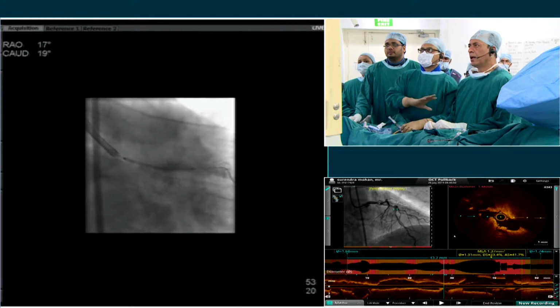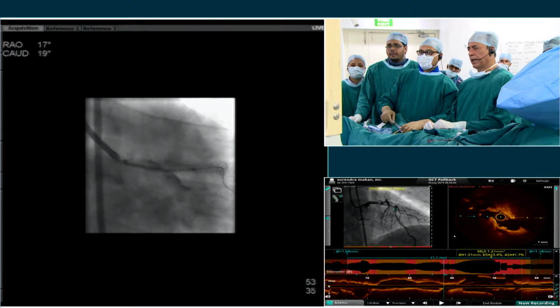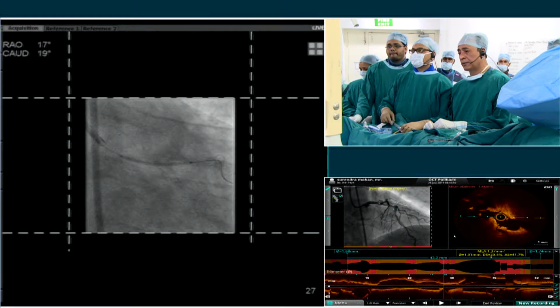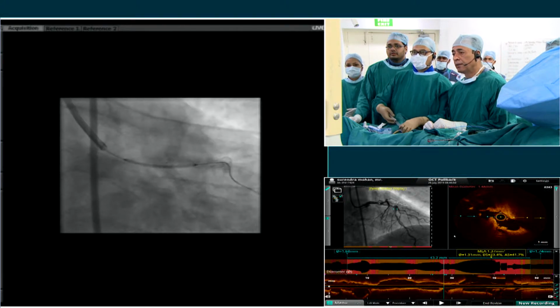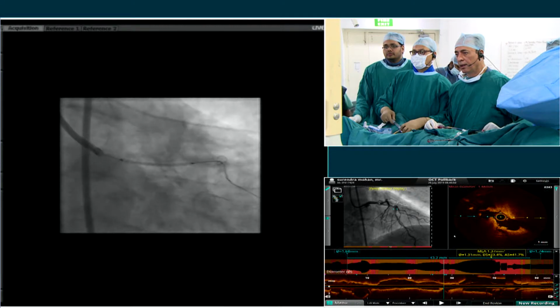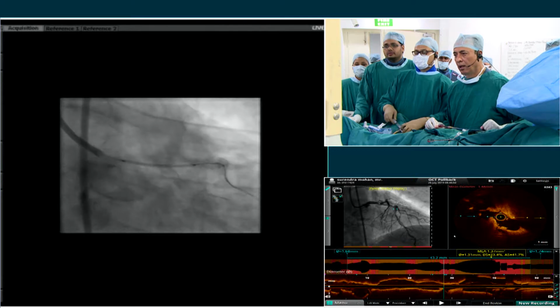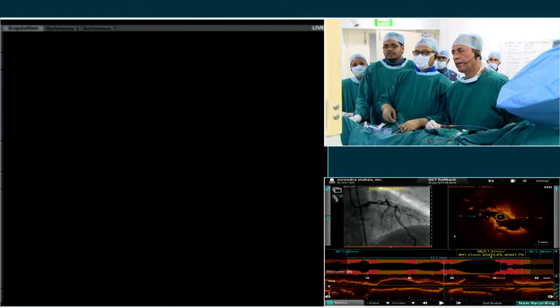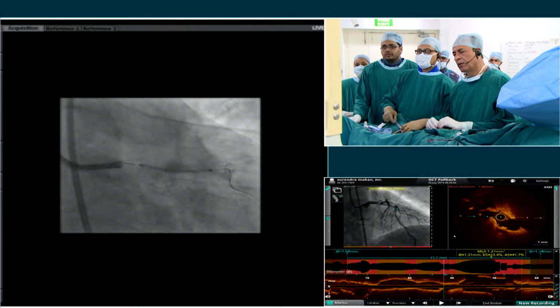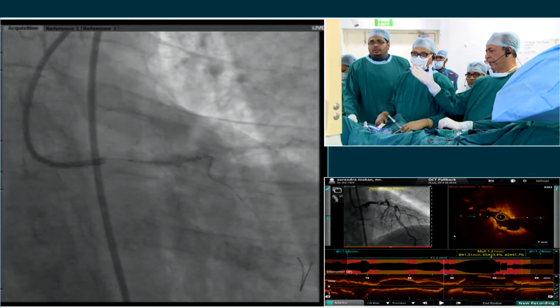No. Which stent are you using? Yeah, we are missing it a little. Inject. The reason I ask is because the Zion lines up directly with the marker, whereas some of the other brands are a little bit inside the marker. So when you're lining it up, you just need to know that for each specific brand to be able to deploy it properly. The Zion stent is the only one where that was open on the marker.